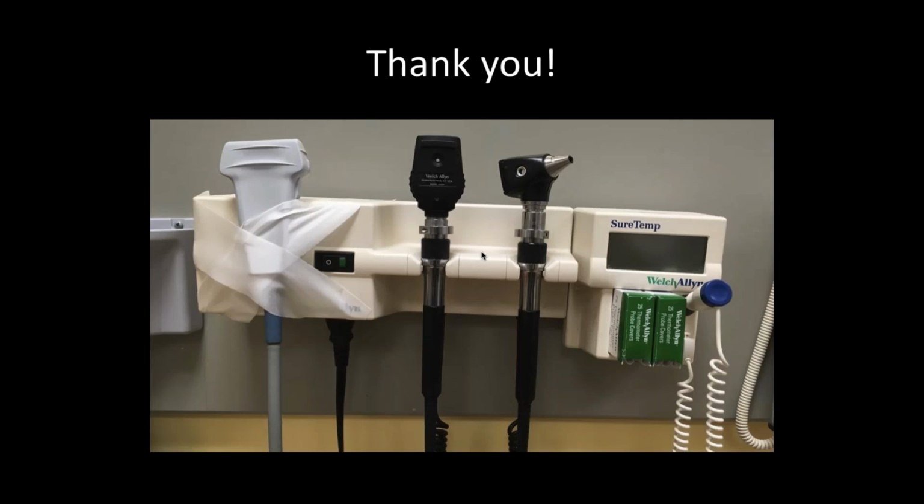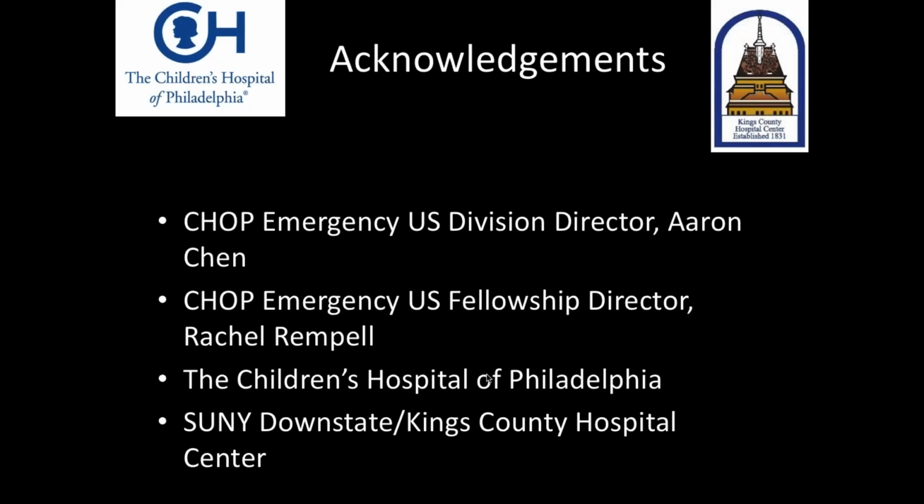And then I always like to end my presentations now to new groups with this slide, because I love my linear transducer here, and I think it should be used just as often as we use the ophthalmoscope and the otoscope. For the pediatric patient, it visualizes so many things that can help us with point of care of our patients.